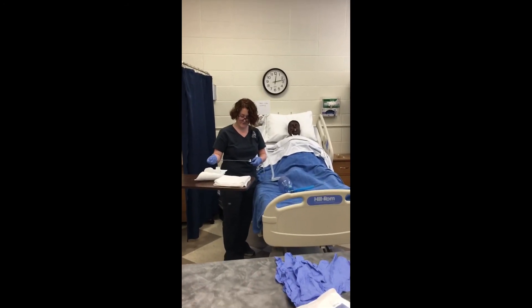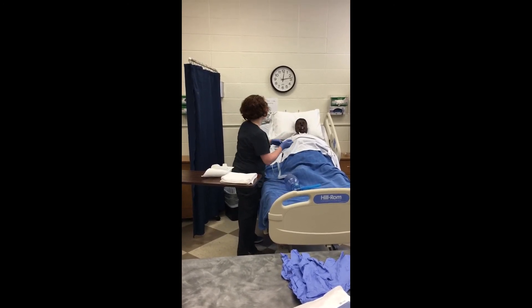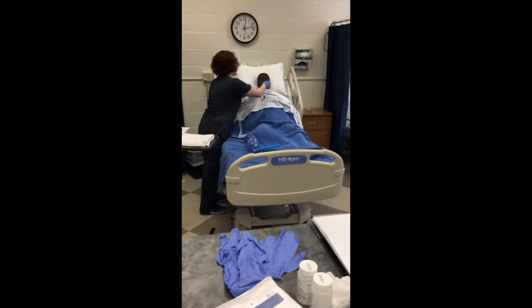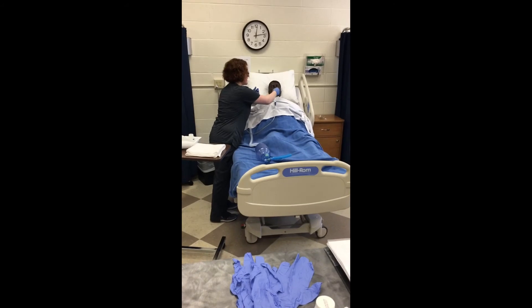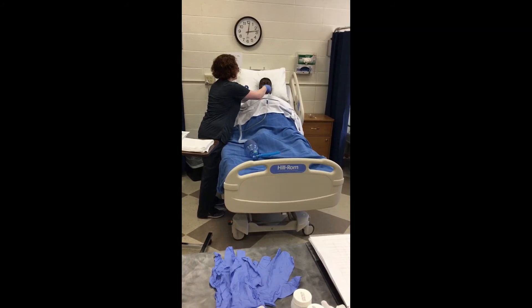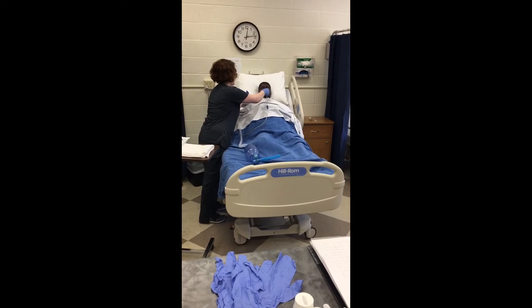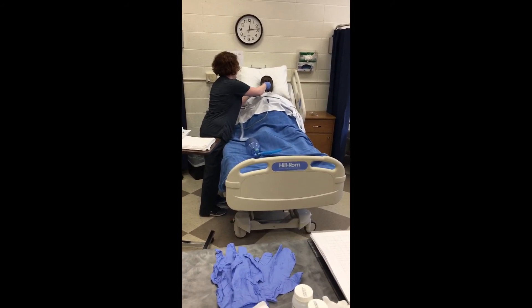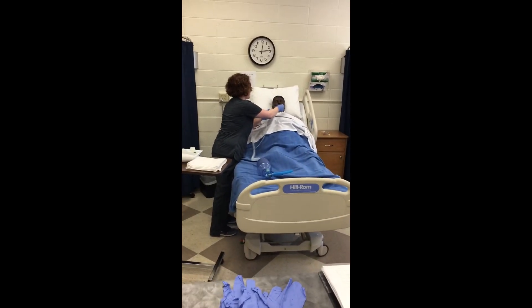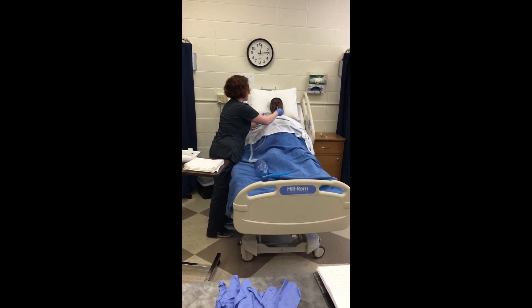I'm going to lubricate this and test it for suctioning by aspirating a little bit — it's working good. I'm going to use my non-dominant hand to remove any oxygen source. Then I'm going to guide this inside the tube without using suction, about 12.5 cm or 5 inches, or until the client starts coughing. Then I'm going to remove it 1–2 cm and perform suctioning intermittently for 10–15 seconds while rotating until it comes back out.